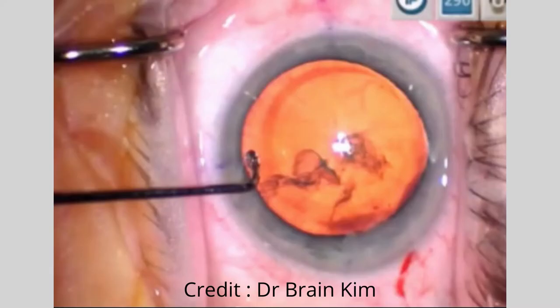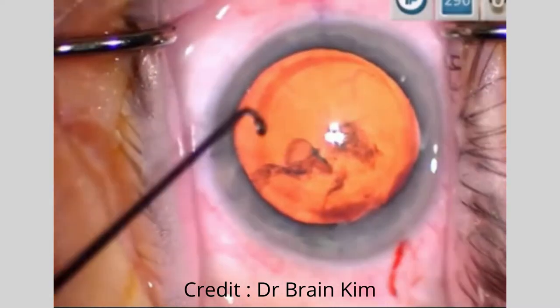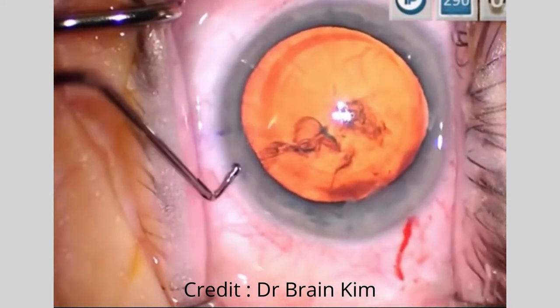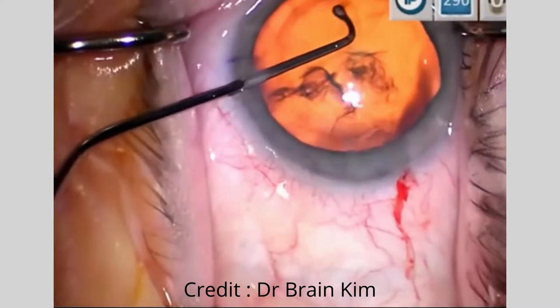This is the proper position of the chopper. When I go into the eye, you want to stay in the pronated position with your wrist, and then you supinate your hand so that the chopper tip is facing you when you initiate the chop. So again — pronation, supination. I like to go in the eye pronated.